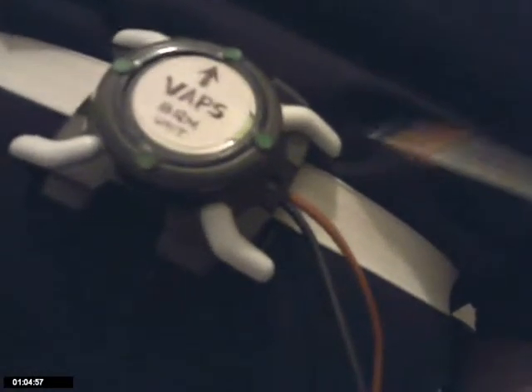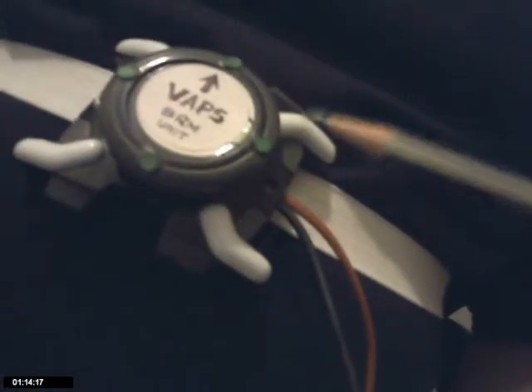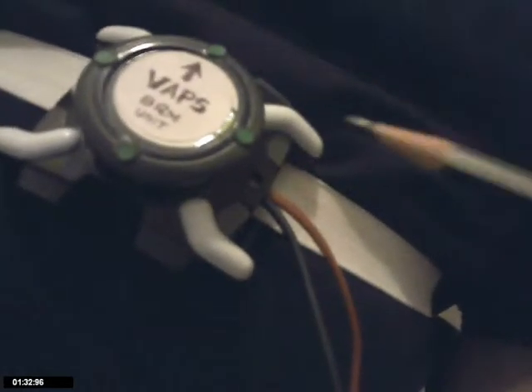You can see the person breathing, and these movements are basically biometric signals picked up by the accelerometer, and they are sent to the PIC32 ADC. The ADC basically finds out the zero crossovers of the periodic waveform and then computes the time period and compares that with three different sets of time periods. One which indicates it's a very normal breathing, an upper limit which shows it's a higher breathing, lower limit shows it's a slower breathing. And slowly I transfer these signals onto the PIC32 board.